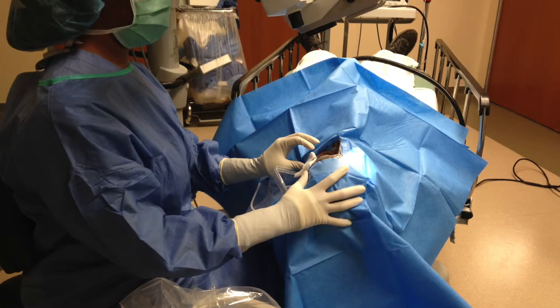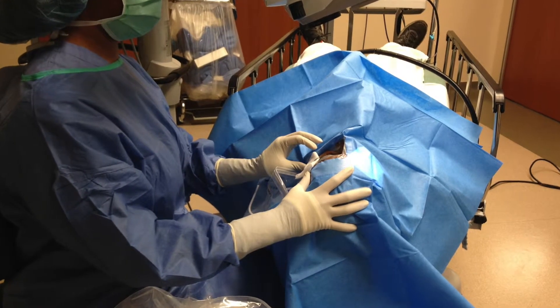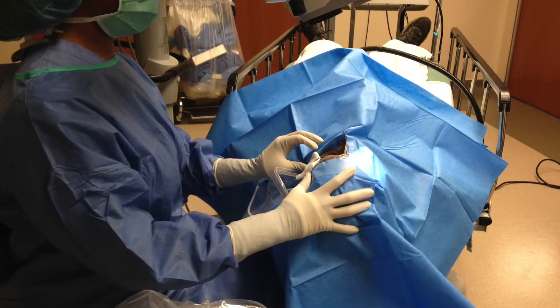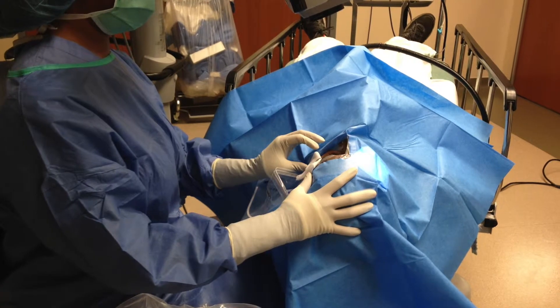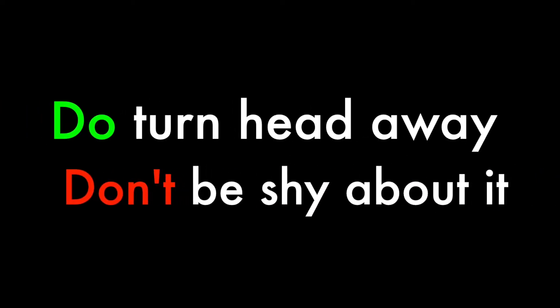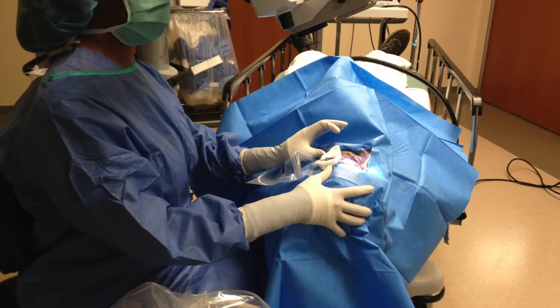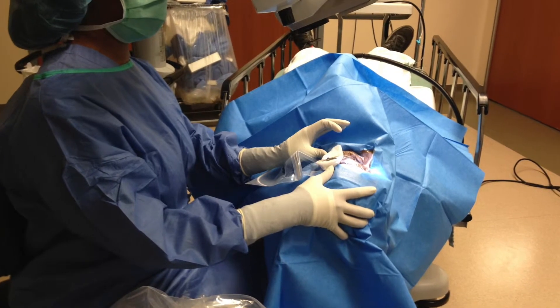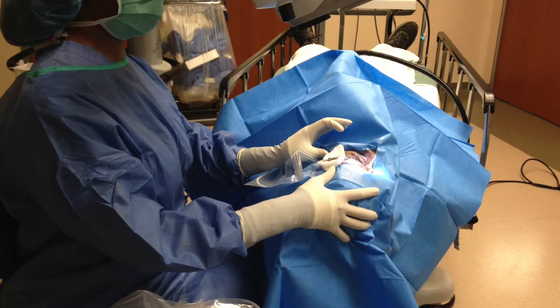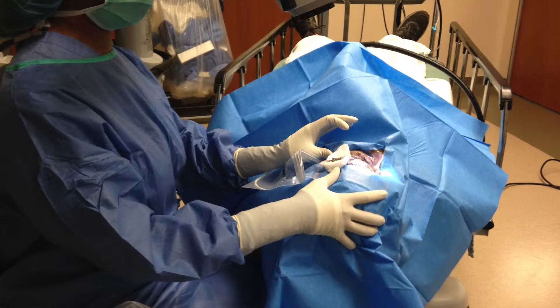Here I'm sitting on the temporal side where the corneal incision will be made. The patient's head is facing towards the ceiling at this moment. Rotate the head of the patient away from the surgeon, and don't be shy about this rotation because it needs to be significant.